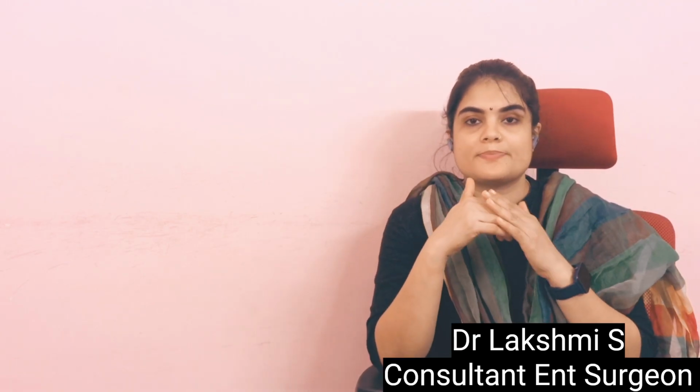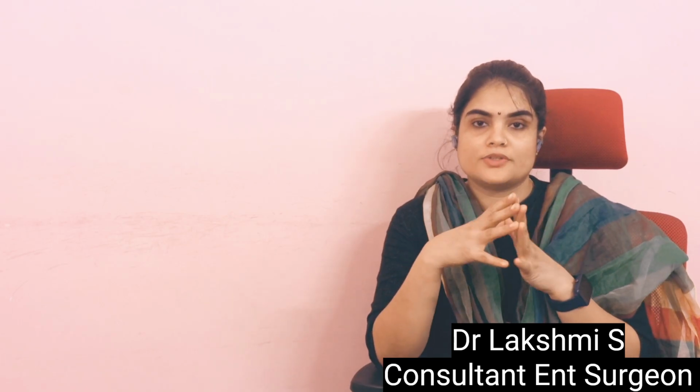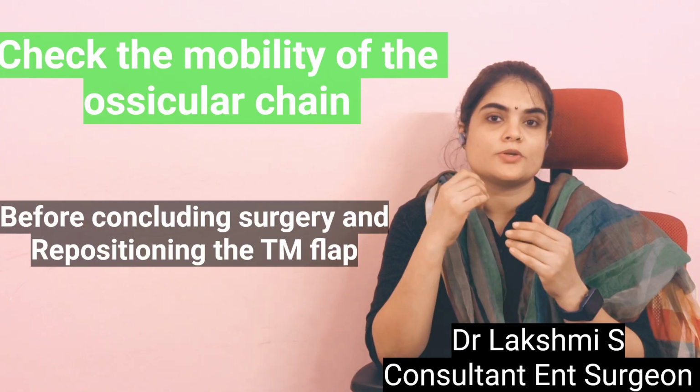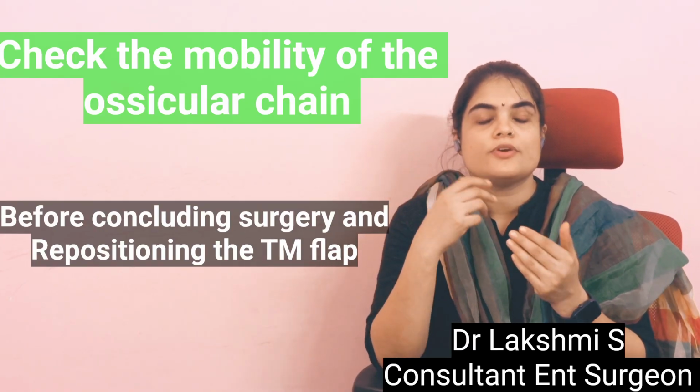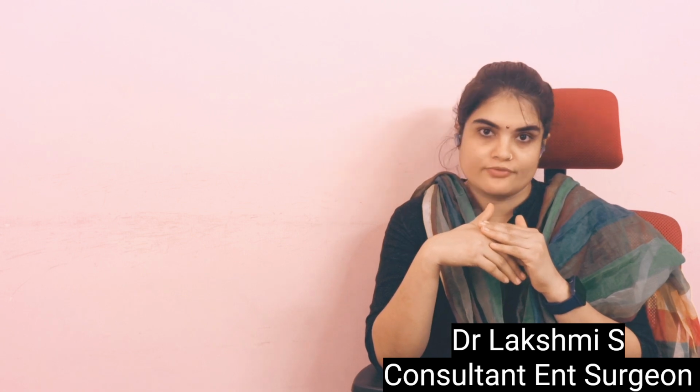Once the piston is kept in place, you can check the mobility of the ossicles. Do not do it more times, because we don't want to irritate the perilymph. So just check for the mobility, and then you can reposition the tympanomeatal flap.